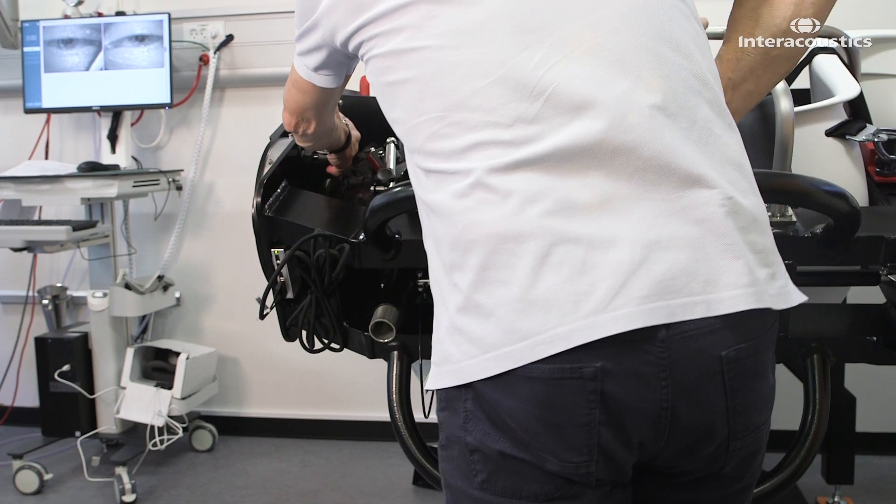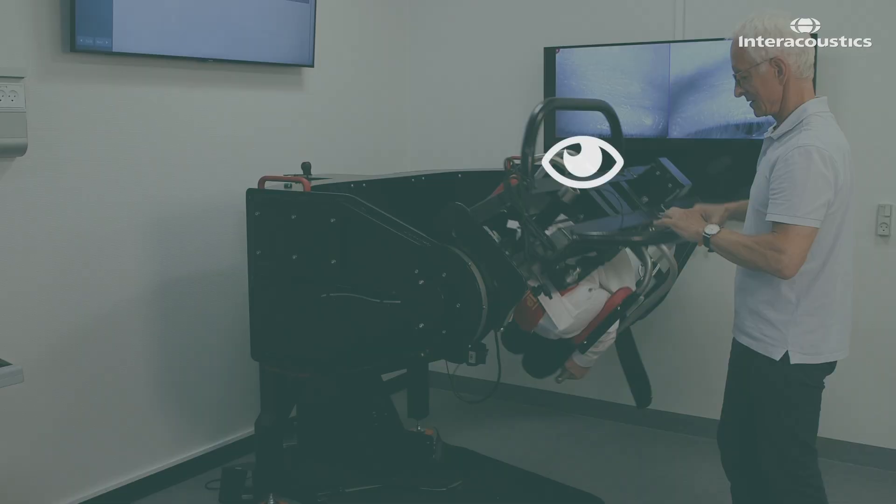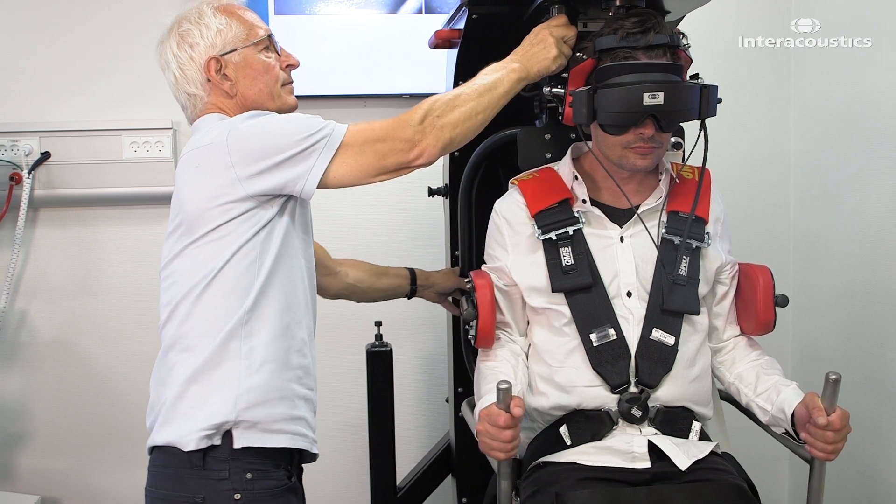Then rotate the secondary arm another 90 degrees over the healthy ear. The patient is now facing downward at a 45 degree angle. Hold this position for another 30 seconds before returning the patient to the upright position.